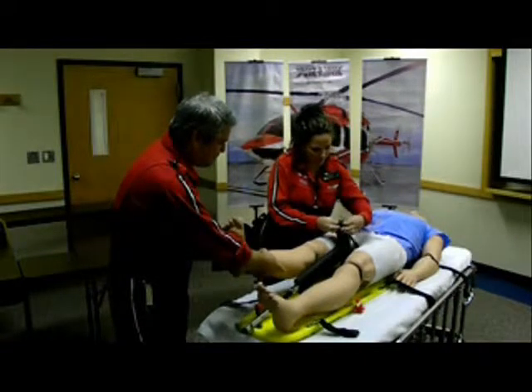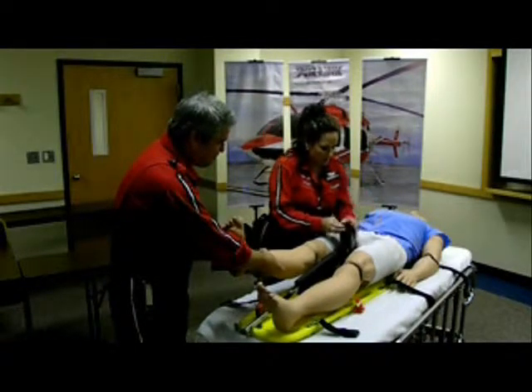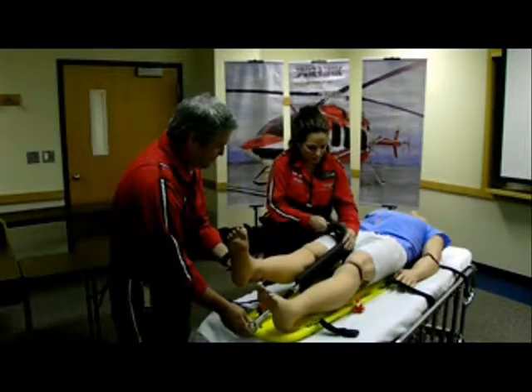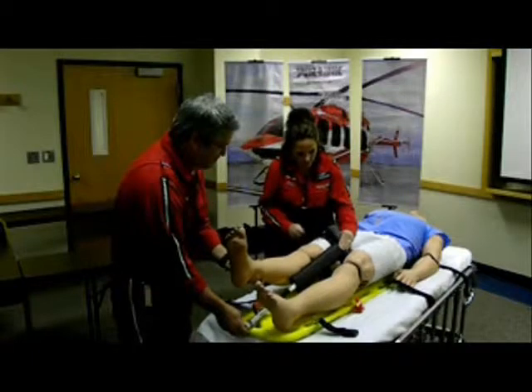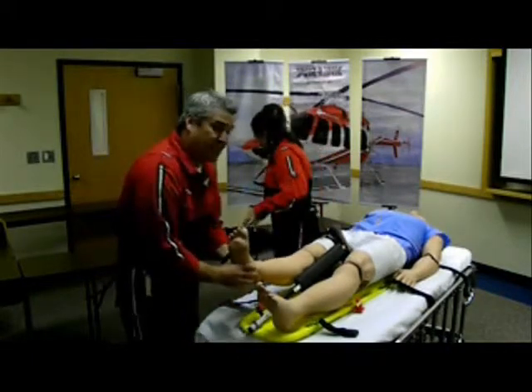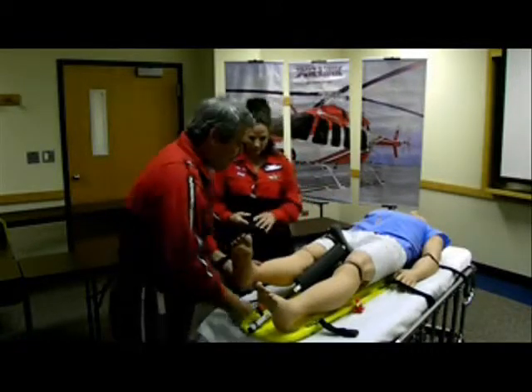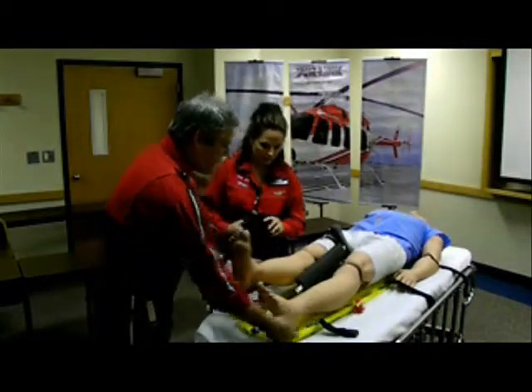Next, place the traction splint next to the affected extremity. Caution to avoid the external genitalia. The ischial strap is secured first and snugly. In the indication for a bilateral femur fracture, you can apply it to both femurs at the same time.